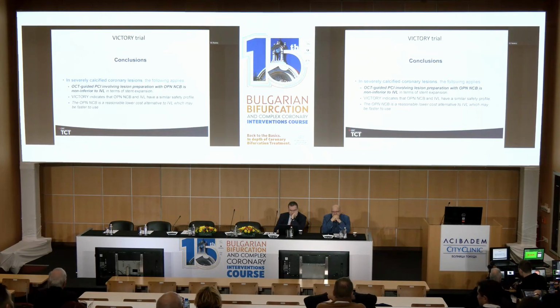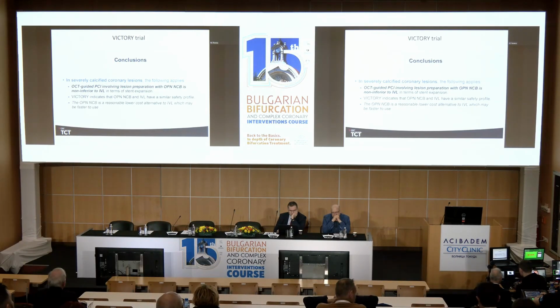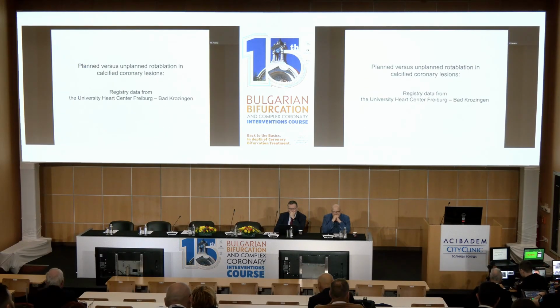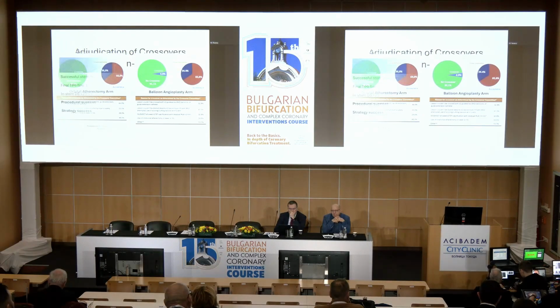So OPN and IVL perform in a similar way according to the study data, and there was also a comparison of cutting balloon with IVL, again a similar level of results. Both studies didn't have a third arm with standard NC balloons at maybe 20, 22, 24 atmospheres. So I show this, but I have to go forward.